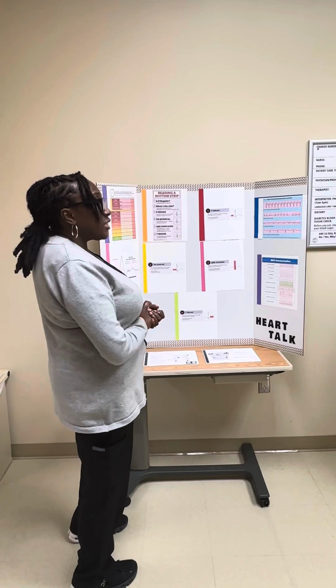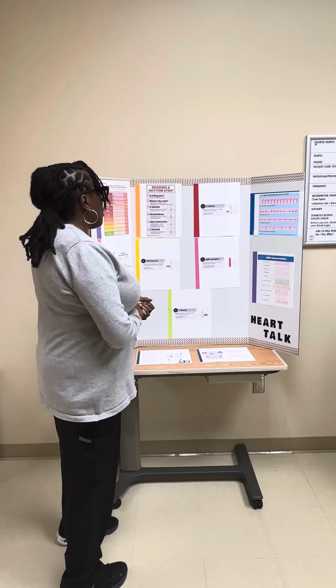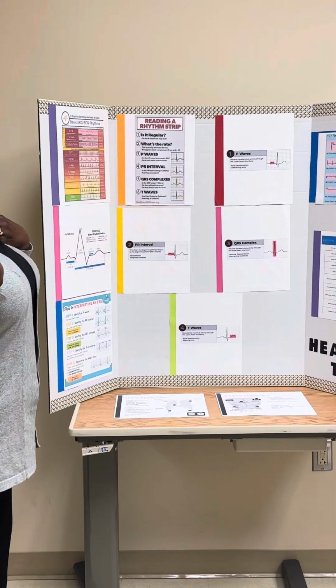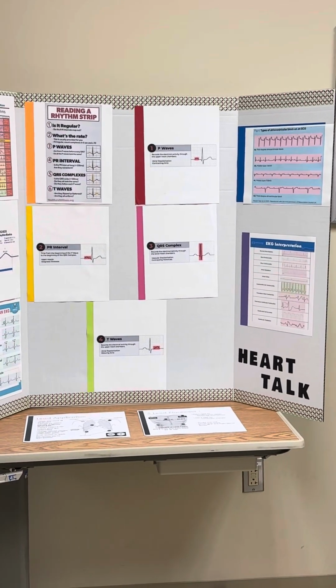And then when we place those leads, we want to make sure we're going back at least every 24 hours and assessing that skin. Again, some of these people have reactions to the adhesive. We all see those burn marks and everything, so we just want to make sure we're rotating those sites, so we have good solid connectivity on those.